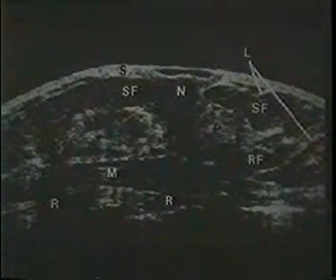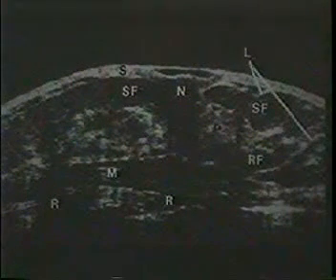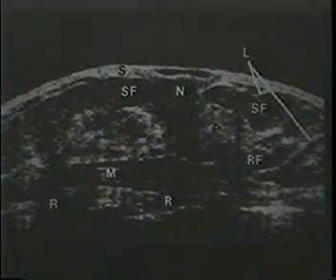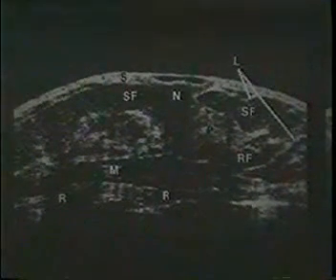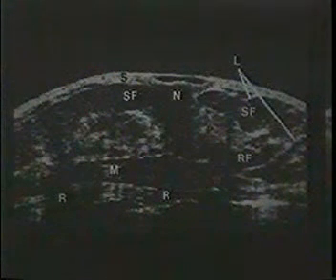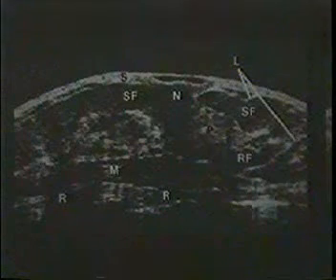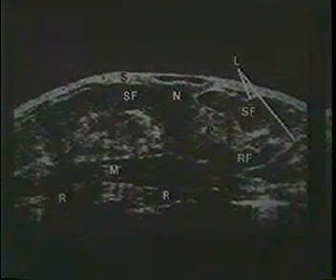Now these are from whole breast scanning, and the only reason I'm showing them is because they're an excellent way to look at the anatomy. But today, we really are not doing whole breast sonography because the only purpose of whole breast sonography was to do screening. Today we do directed ultrasound. In fact, we don't want to have information usually outside of the area of clinical interest.